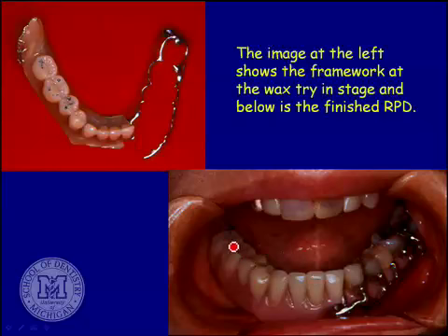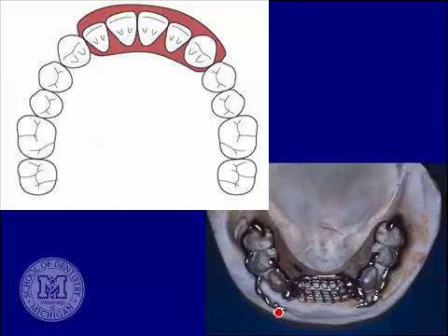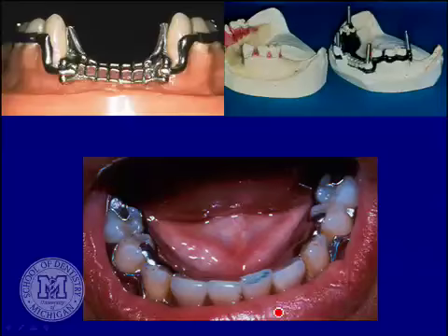Just under the partial denture framework in this area, you'd have a couple of Zest locator attachments and it would just snap down. And again, when these frameworks were in vogue, we did not have that as one of our options. And so we can just look, here's another one that clasps teeth in 2 different ways. Again, these would get to be very expensive frameworks. They worked out okay.